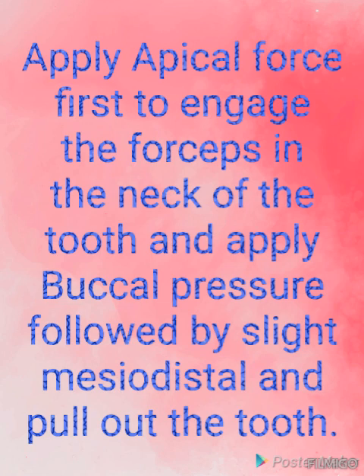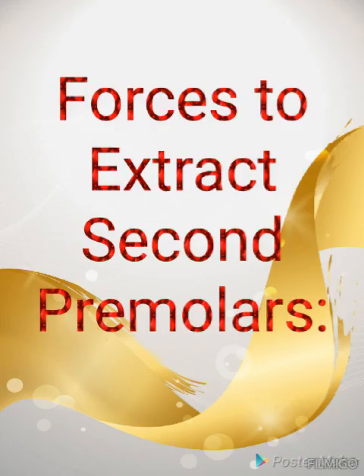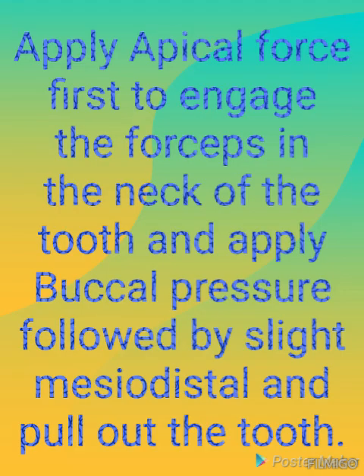And next we are going to see how you will extract mandibular second premolars. So, forces to extract second premolars. Apply apical force first to engage the forceps in the neck of the tooth and apply buccal pressure, followed by slight mesiodistal movement and pull out the tooth. The mandibular premolars are the same. First and second premolars have the same movements only. There is no difference in movement.